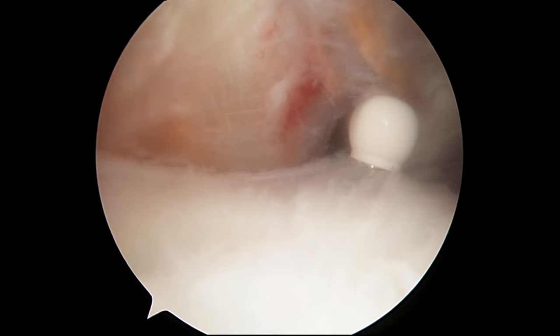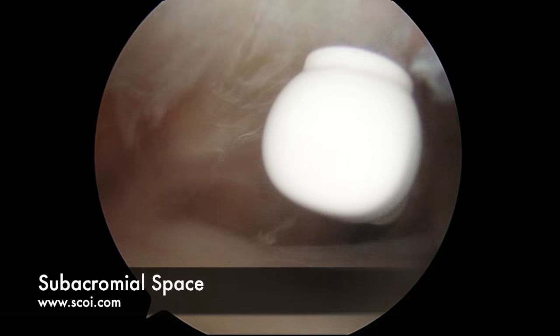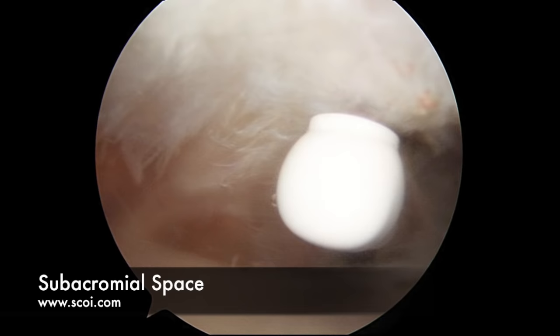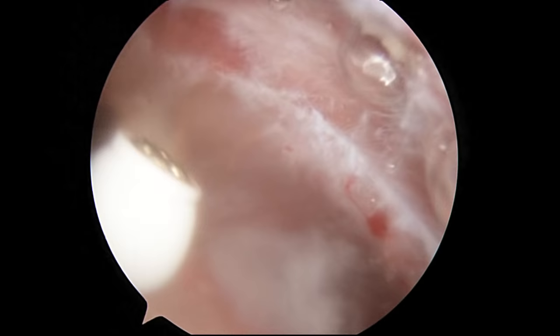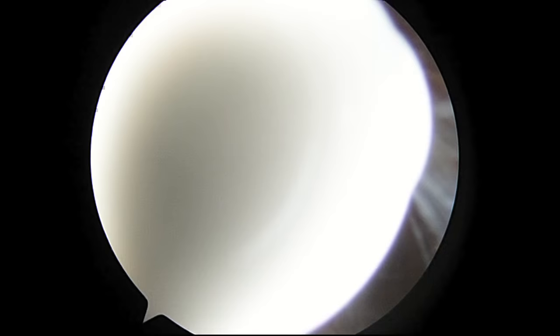Just like we do in the glenohumeral joint, we put the arthroscope on both sides of the shoulder and evaluate the subacromial space. The roof now is the acromion, covered right here by the coracoacromial ligament or CA ligament. If people have significant impingement, this ligament is often very scuffed and frayed — there is mild scuffing here but not too bad. This is a radiofrequency device that we can use to cauterize any little bleeders present after our bursectomy, which will make visualization easier for the surgeon.